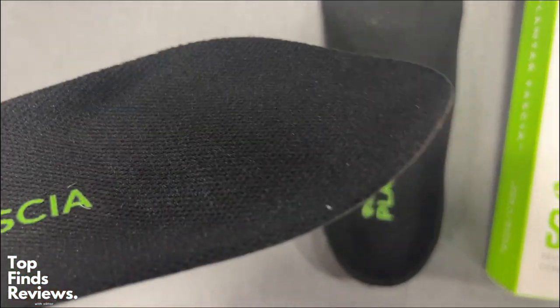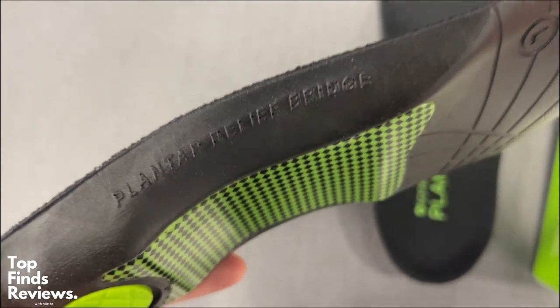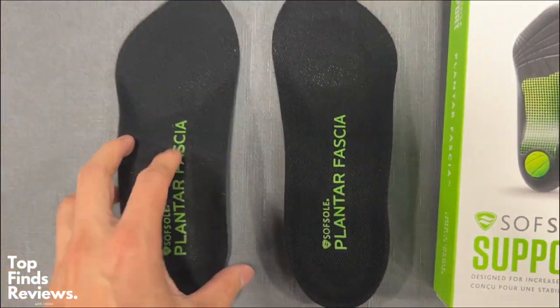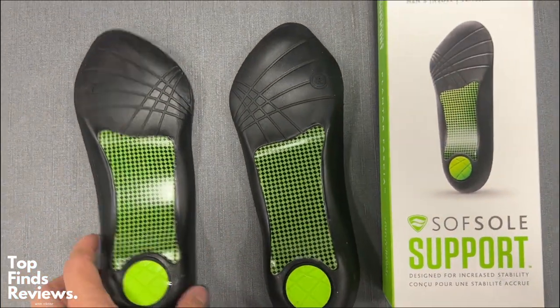This one personally is not my favorite — I give it a three out of five — but depending on your use case, your heel arc, or anything like that, this might be perfect for you.